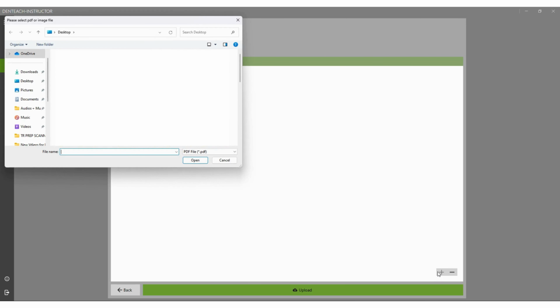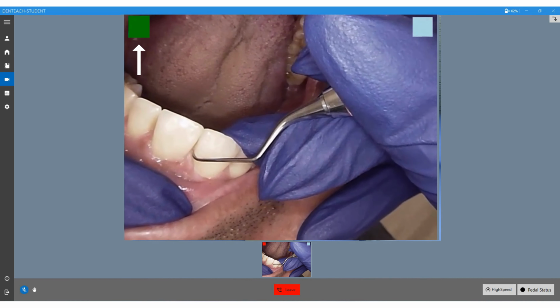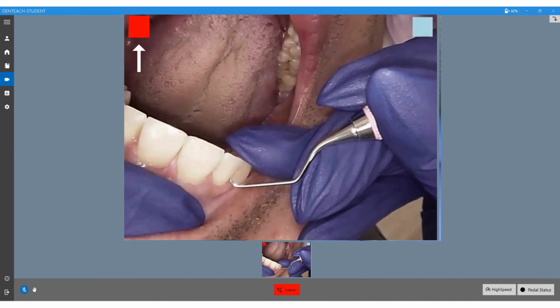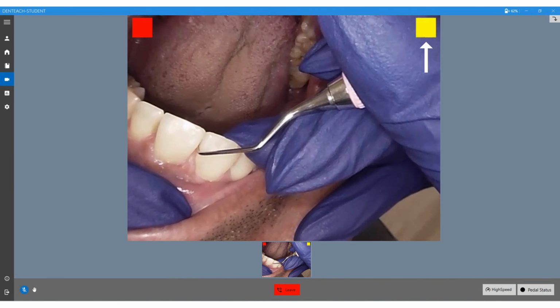Additionally, instructors can upload lecture notes, accessible by students anytime, anywhere. The augmented reality feature educates students on the correct handling of dental equipment. Notably, the vibration feedback box alters its color depending on the pressure exerted on a tooth.